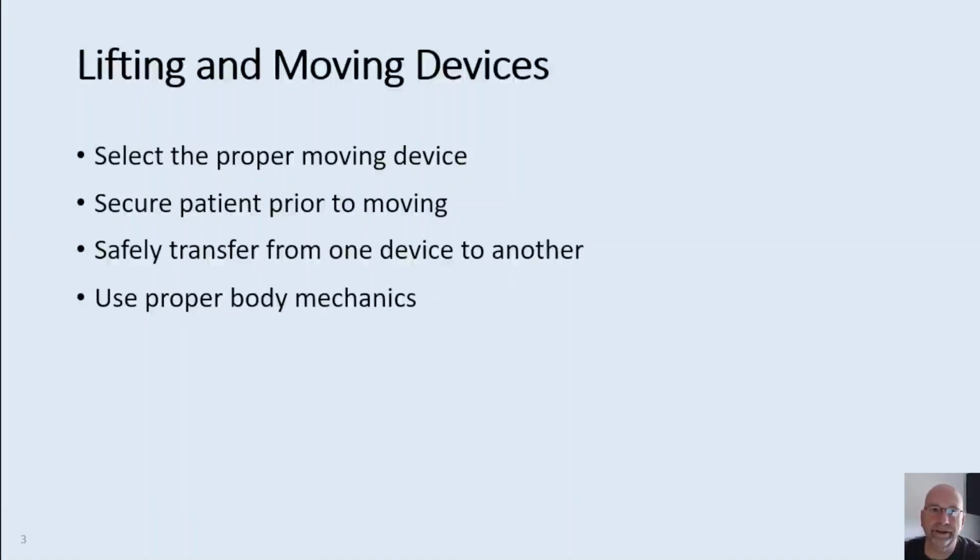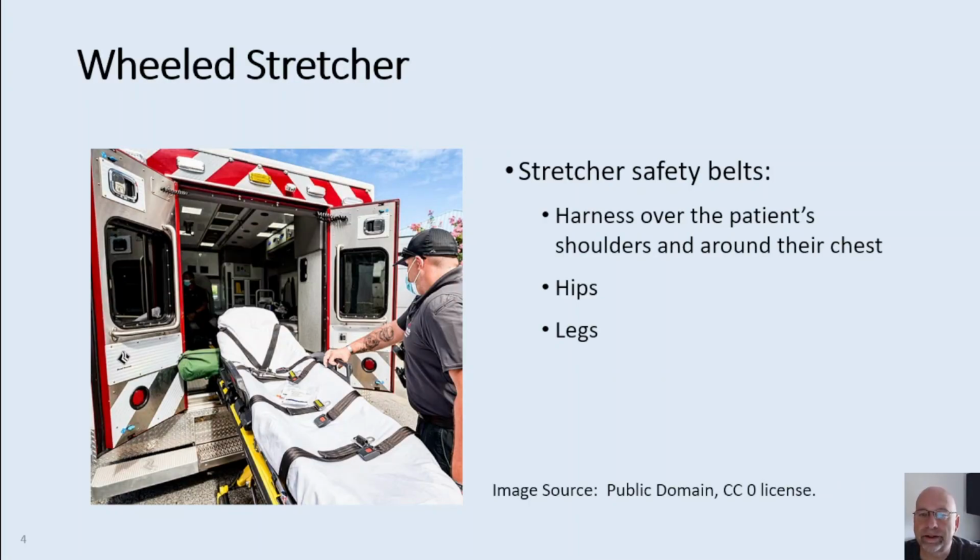transfer our patients. The wheeled ambulance stretcher is designed to safely secure a patient for transport in the back of the ambulance. Since these stretchers can weigh anywhere from 80 to 150 pounds, they are not designed to go up and down flights of stairs. Older style ambulance stretchers require at least 2 EMS providers to safely raise and lower the stretcher and to load and unload a patient from the ambulance.